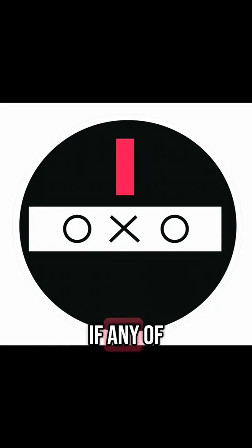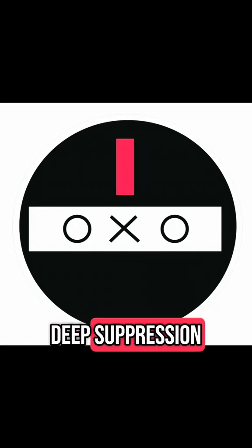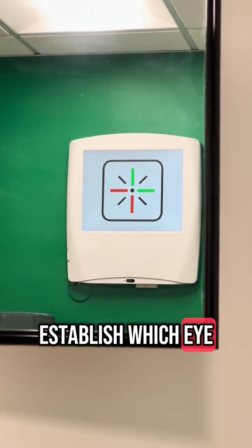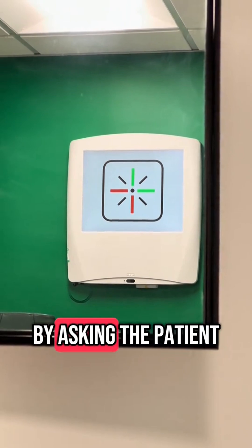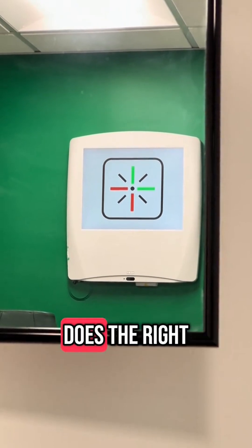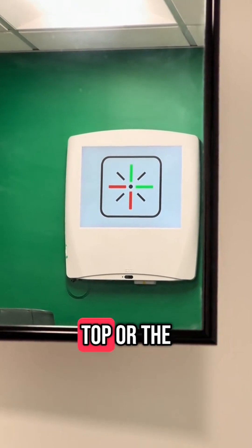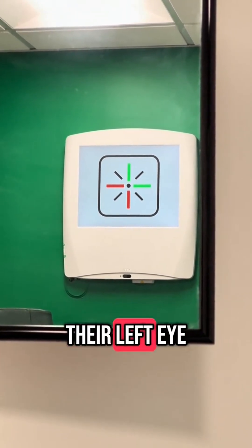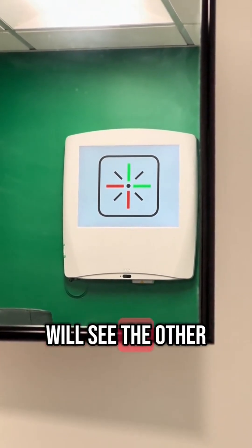If any of the lines are missing, there may be deep suppression. Establish which eye sees which line by asking the patient does the right eye see the top or the bottom line. Their left eye will see the other.